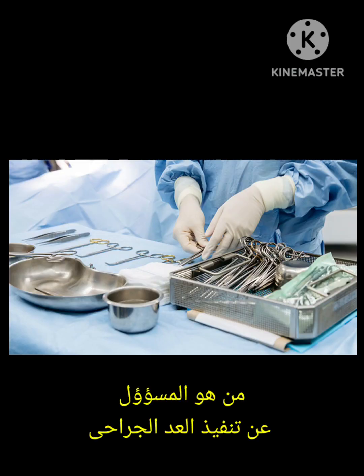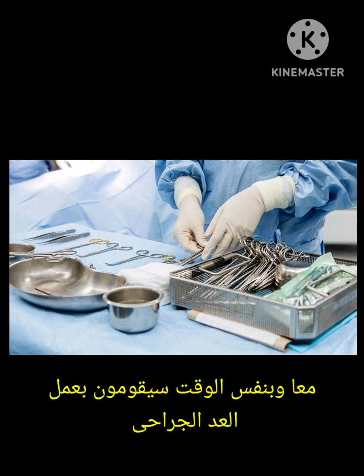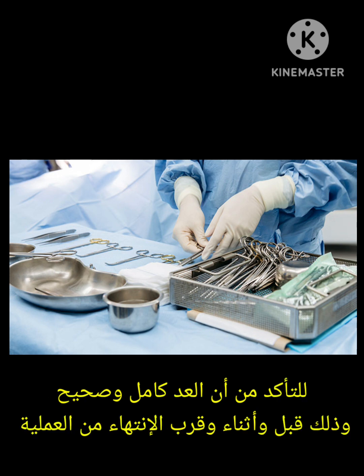Who will do the surgical count? This is one of the most important roles for the scrub nurse and circulating nurse. Together they will do the surgical count and confirm it is complete and correct before closing the skin and before finishing the operation.